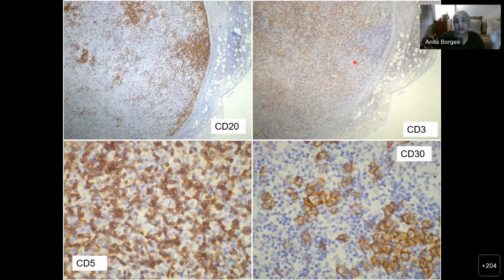So this is a lymphoid follicle, and you can see that even in the CD3, but the mantle has not settled down around what you should see as a well-defined follicle, so to speak. This disease is not just within the lymph node, it is also outside the lymph node. It has gone into the fat, and even there it is mainly a T cell sort of thing.